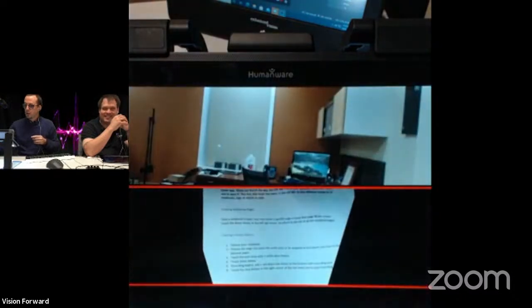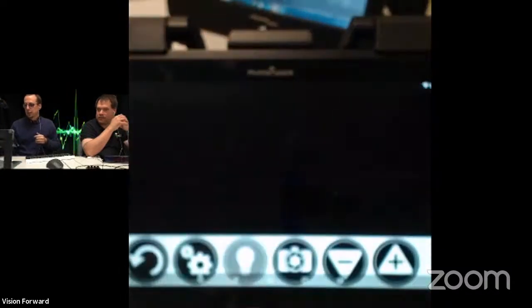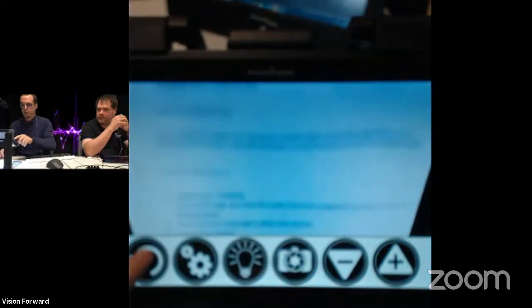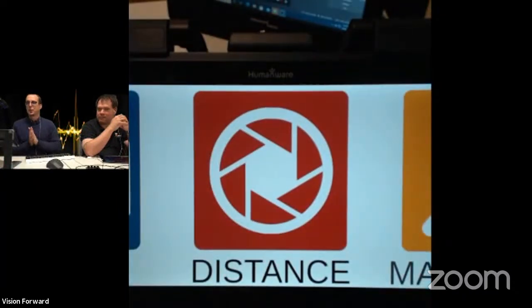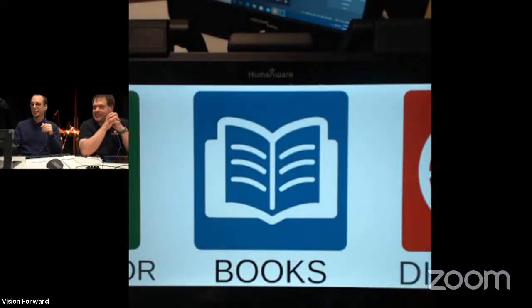That's good. Okay, now the question is, how can I get back out to the regular mode? Because we seem to have a little glitch here. I think you have to hit the home. Yes, we've got a little glitch going on, but I think we've managed to get out of it. Back and forth. I literally did a software update on this device a few minutes before we started. Always the best idea when you're about to go live. Yes, indeed. What could go wrong?